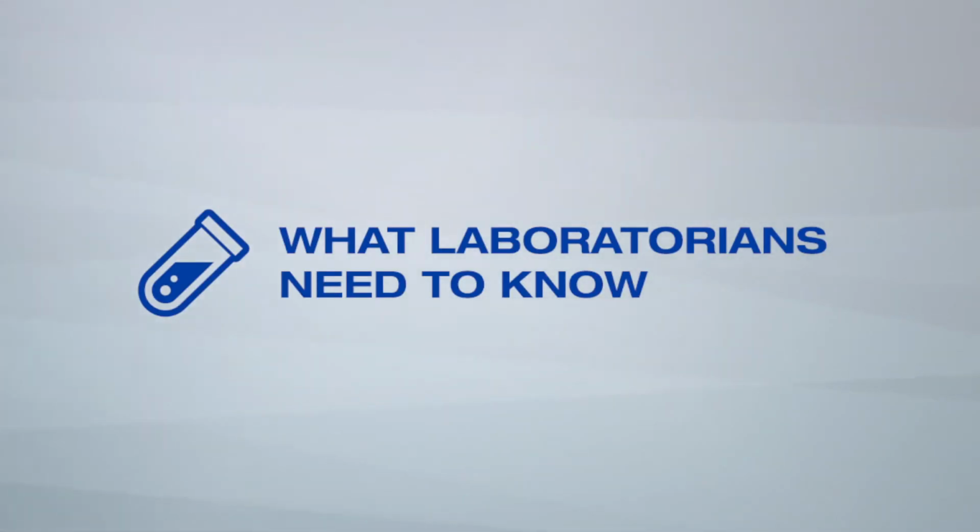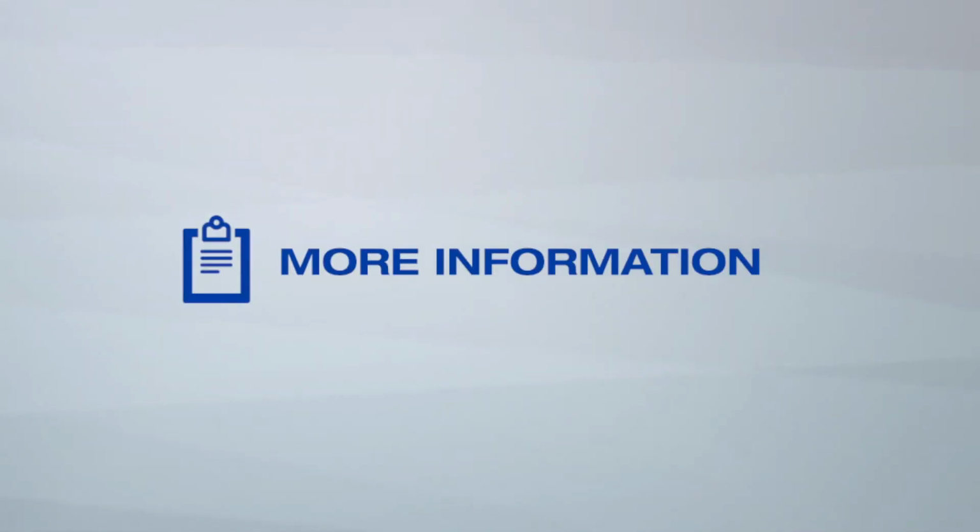The test is performed using an NMR machine, and it's actually a pretty highly automated NMR instrument, so not a traditional instrument like many people are used to. So this test is not designed or meant to replace traditional lipid screening or testing. It's really meant as a supplement, so it should be looked at as advanced lipid testing.